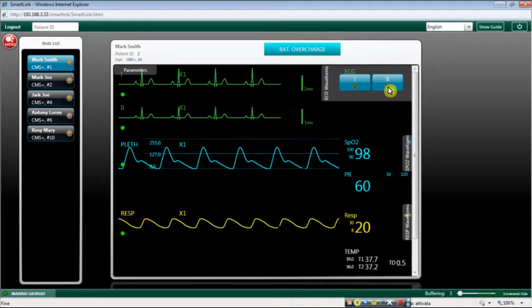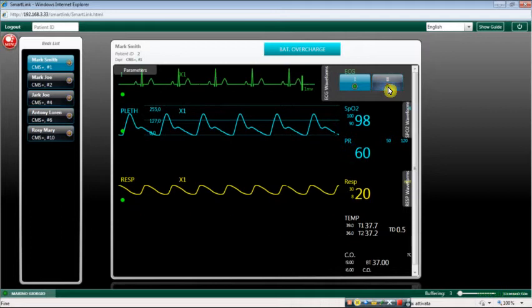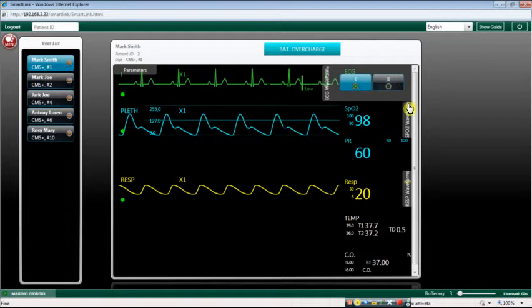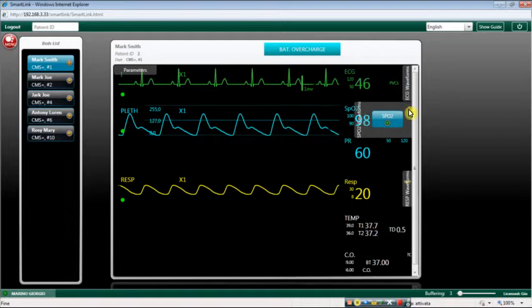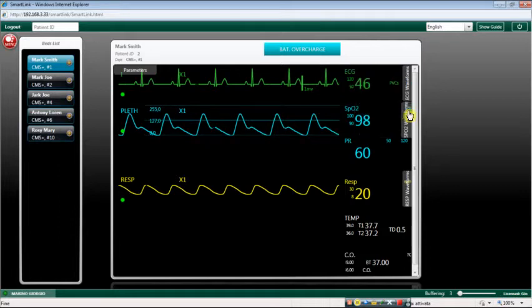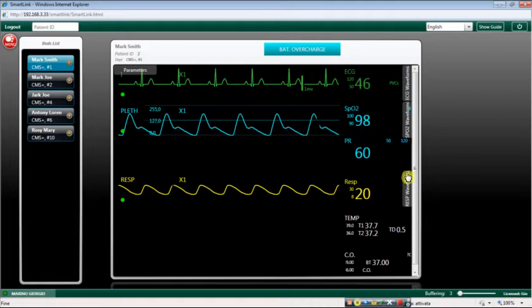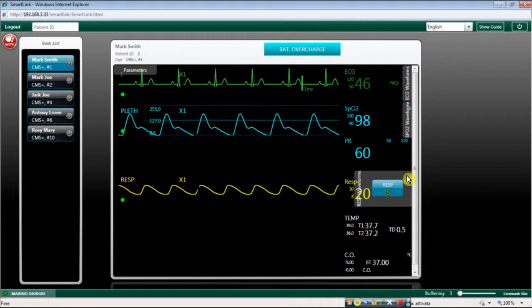Different monitors can have different waveforms sets. A currently displayed waveform corresponds to a blue enhanced button, while a grey button indicates an available but not currently displayed waveform. Click on a waveform button to select or deselect the corresponding waveform.